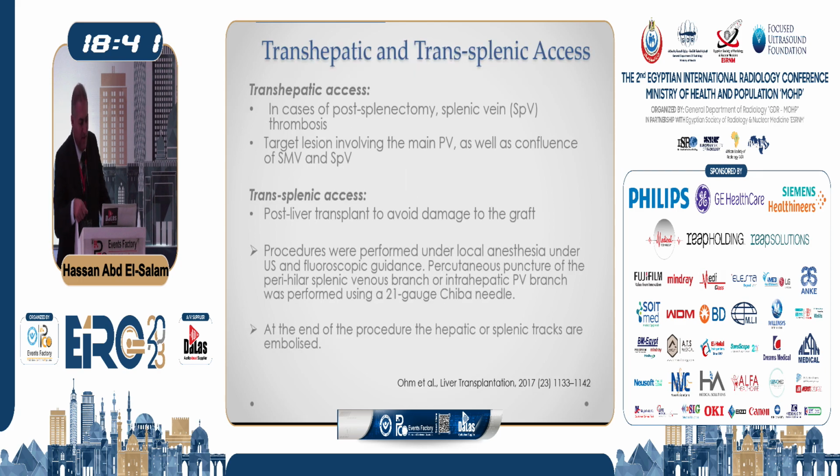Transsplenic and transhepatic approaches. In cases of post-splenectomy, or target lesion involving the main portal vein, we use the transhepatic approach. For the transsplenic approach, we use it in cases of liver transplant or procedures performed under local anesthesia under ultrasound and fluoroscopic guidance, percutaneous puncture of the perihilar splenic venous branch or intrahepatic portal vein branch. At the end of the procedure, the hepatic and splenic tracts are embolized.